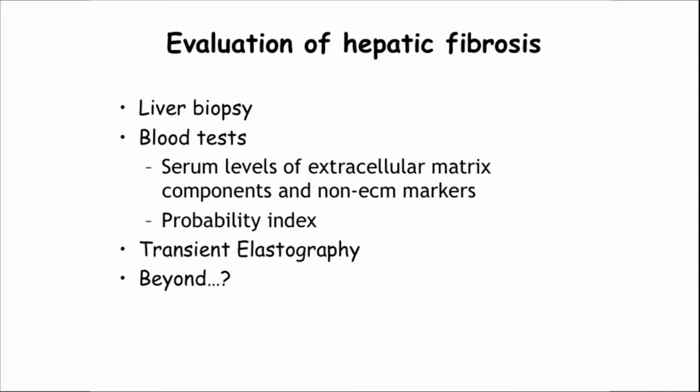So how can we evaluate hepatic fibrosis? What are the tools that are available to us? Well, clearly up until the last few years, liver biopsy has been seen as a gold standard, and liver biopsy still is a good way of assessing liver damage.